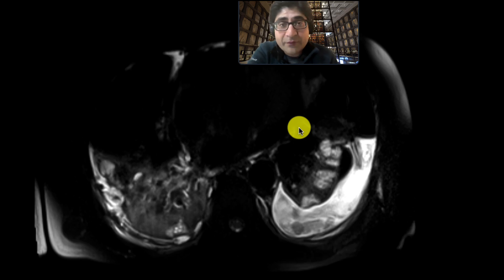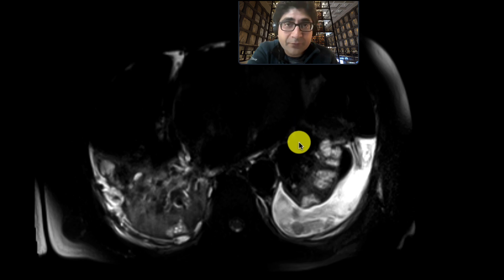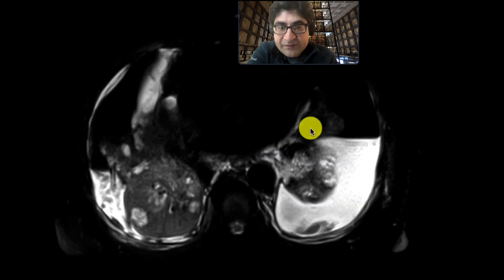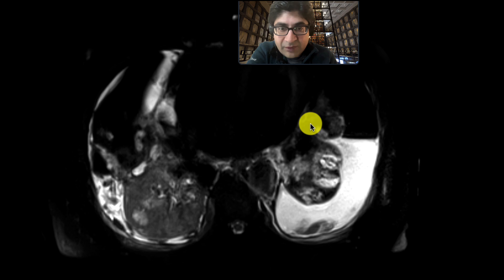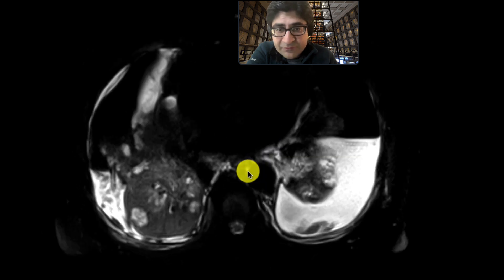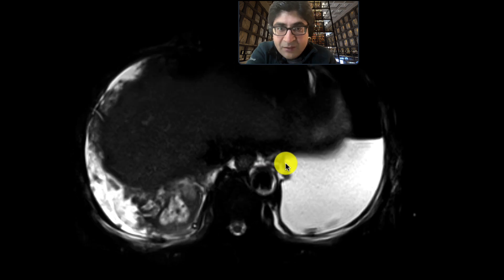This is a patient who came in with abdominal pain, got a CT scan that showed some dilated bile ducts, and then got an MRI to further evaluate this. As we look at the MRI sequence, the patient is quite sick. We can see a lot of abnormality in the lungs with effusions and consolidations. There's also a pleural catheter over here at the right lung base.